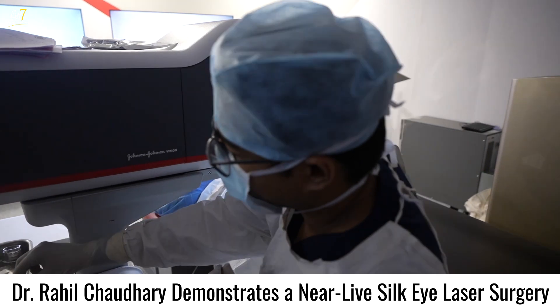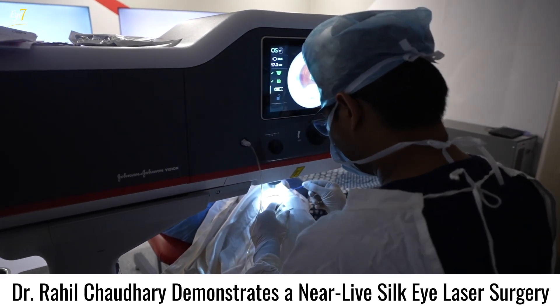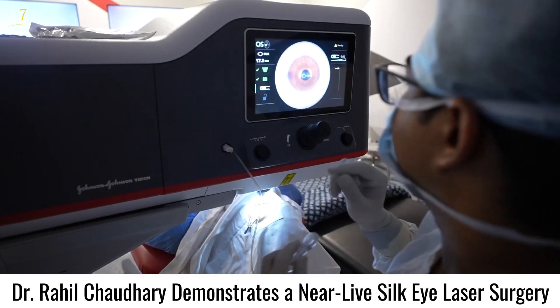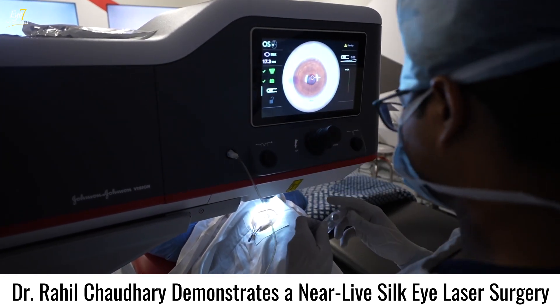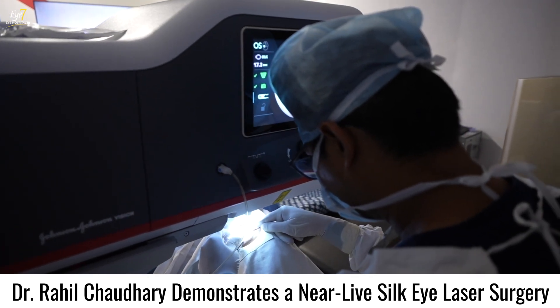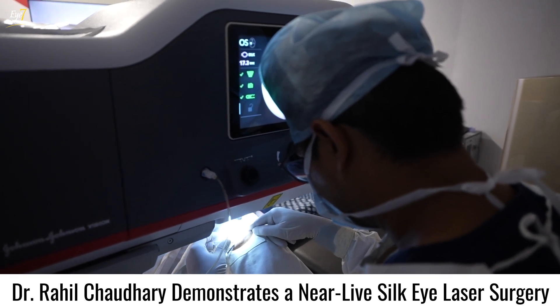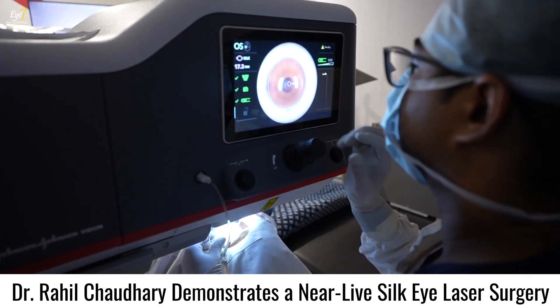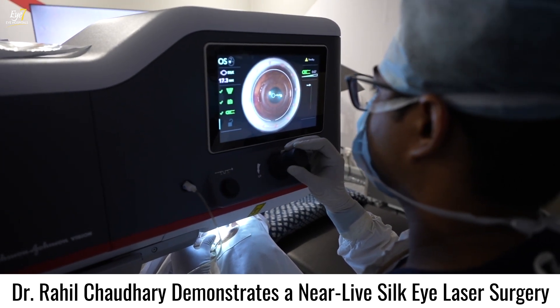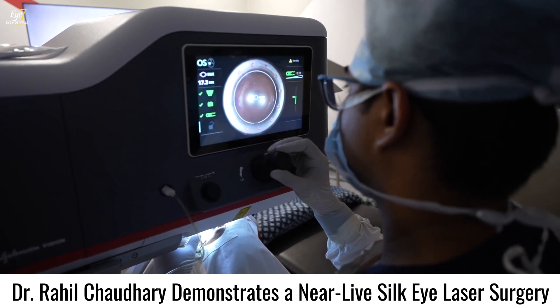Before starting the procedure, make sure the cornea is nicely cleaned — this is the suction ring — and any meibum debris or other debris is properly removed. Now we place the suction ring onto the eye. At the moment it is two-piece, but very soon we will have a single-piece suction patient interface. I am still very comfortable with the two-piece because: number one, it gives better control; number two, there is no uprolling, so you prevent a lot of vertical coma; and number three, it provides a strong suction.